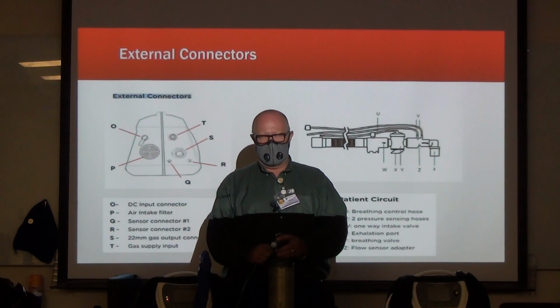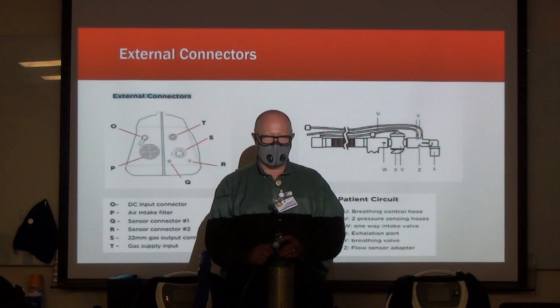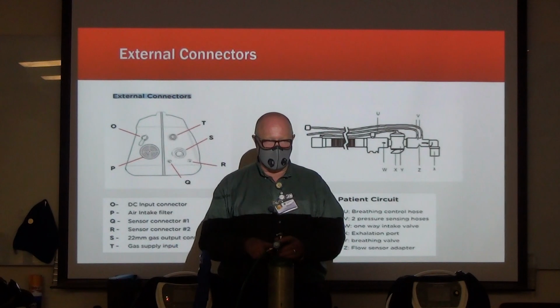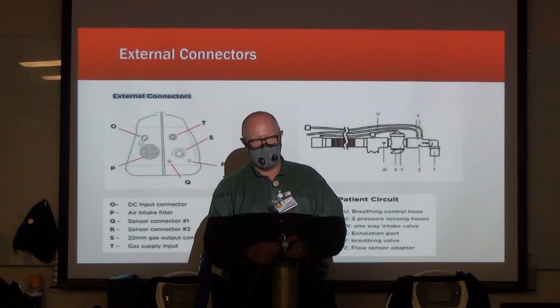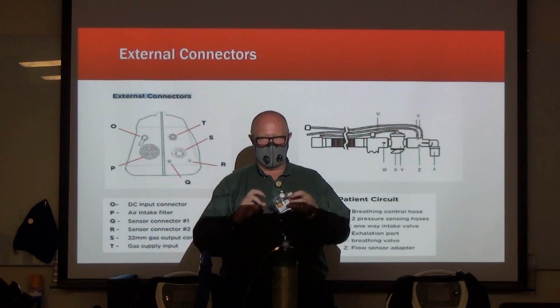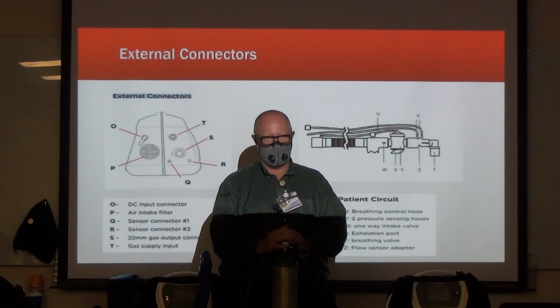So if you know on your other vent you have a quick connect, make sure that whenever they're swapping those out, you take that off and put that with this one, because you'll need it, especially when you're in the facility or in the back of the ambulance. You'll be able to take this off from the tank, put that on, quick connect in, and then that will actually give you your supply off your truck.